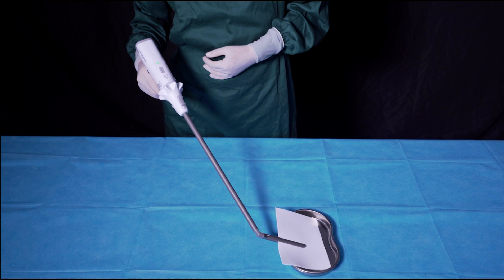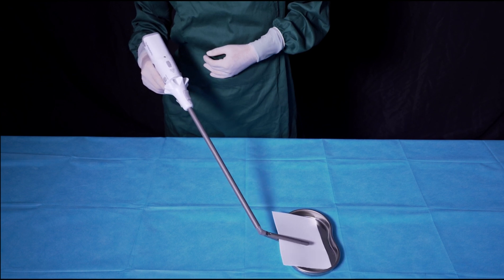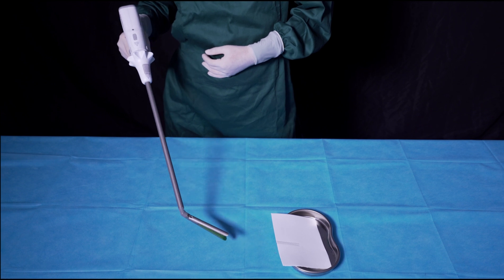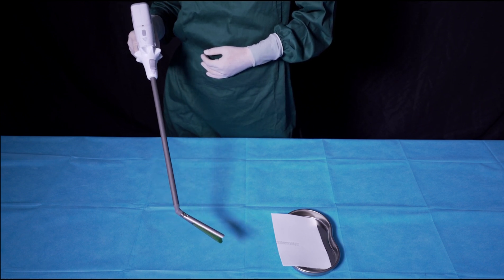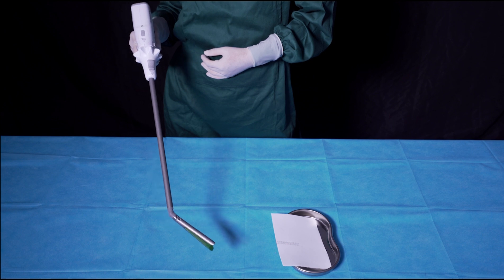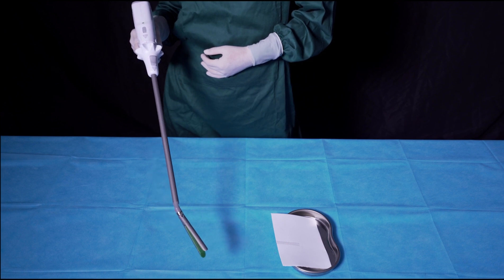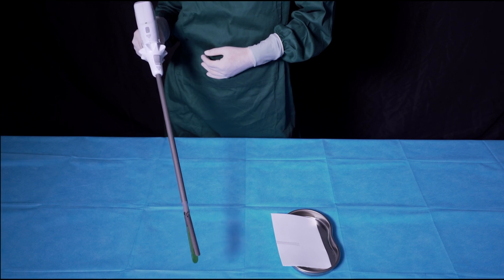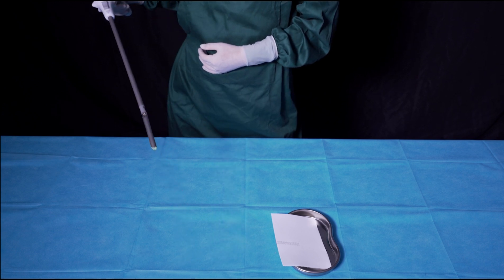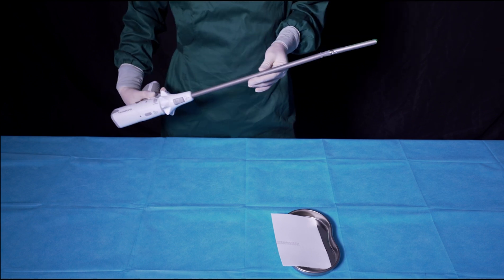After the anastomosis, press the reverse button to withdraw the knife and open the jaws before removing the stapler. Keep the jaws open within the range of visibility. If firing under articulation, long press the deflection button to get the jaws returned to the middle. Long press the close button to close the jaws and take the stapler out.